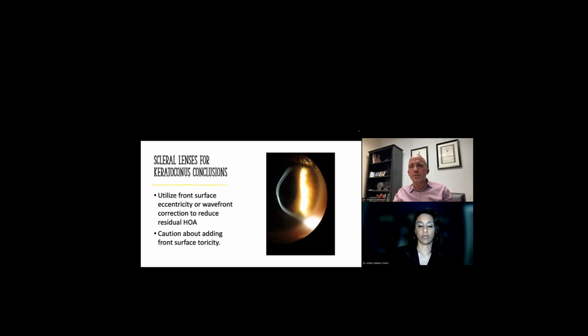And beyond that, the other factor that you have to consider for yourself and the patient is just more chair time, because you're going through another two or a couple lenses at least, at minimum. And I think you just need to sit down and think, is this worth it for this patient? They might do great, like the patient I presented, but I've had patients where no change or sometimes worse. And that's hard, when you go through all that extra work, potentially more cost, and the patient doesn't benefit.